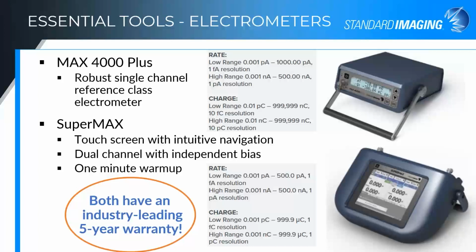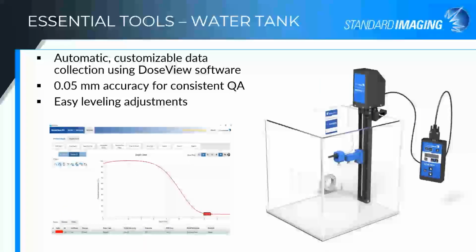That's great. So, of course, I have another question because I'm the queen of questions here. So can either of these electrometers be used with, like, a 1D scanning system? Yes, they both can. They both work just fine with our DoseView 1D tank.